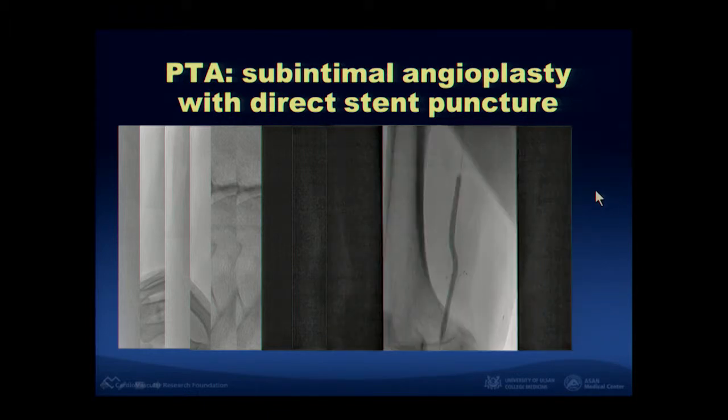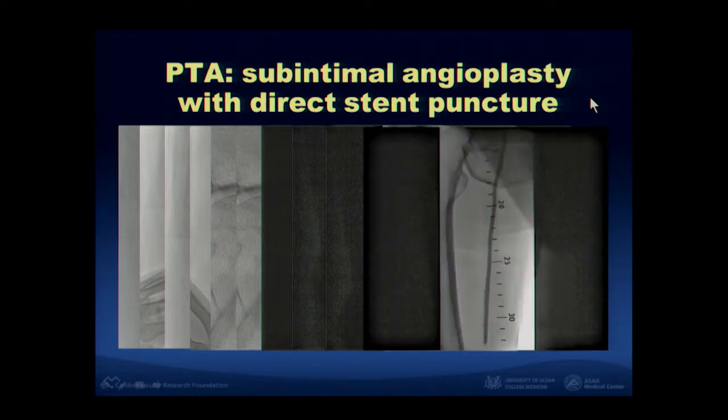So I achieved the wire passage, and then balloon angioplasty again. So we also achieved a good result like this. So in the in-stent ISR portion, sometimes the stent puncture is very useful.